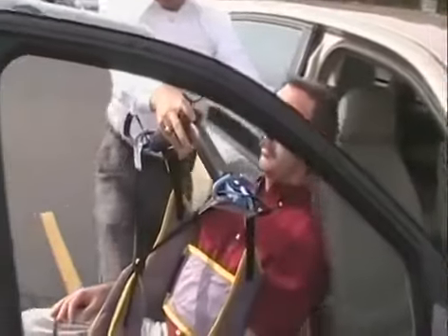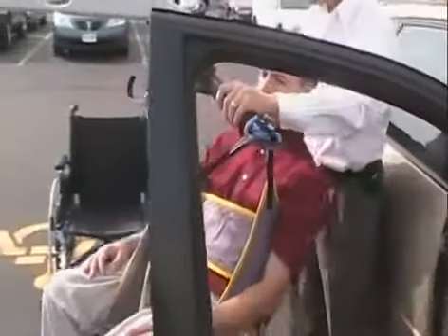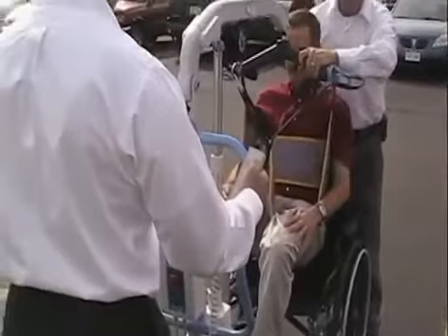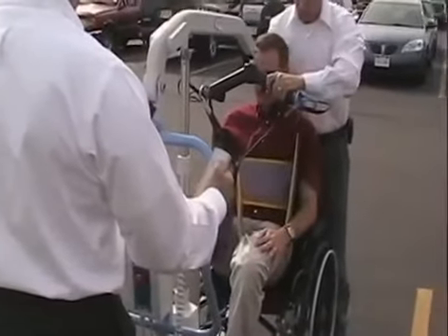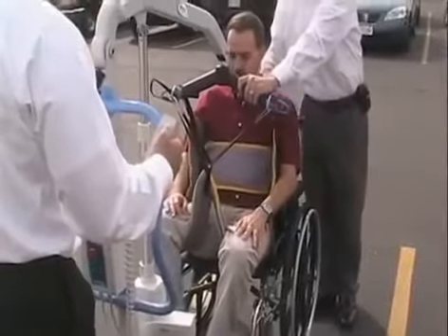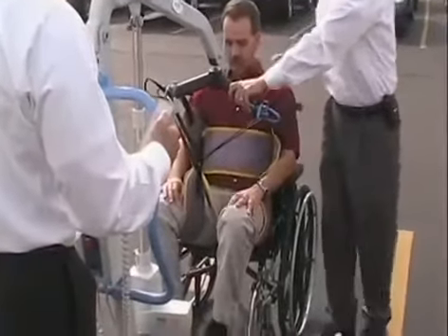And doing so, we're going to pivot you here. We're going to place you right in the wheelchair. We're going to go ahead and make sure that we lower you down so that you're comfortable and fitting in it good. We're going to do so by making sure that the back's in place. And as we're doing that, we're going to back up the lifter just a little bit to give you a little bit more distance.